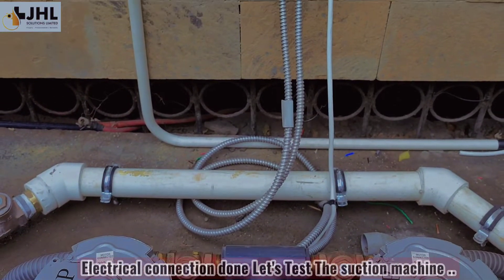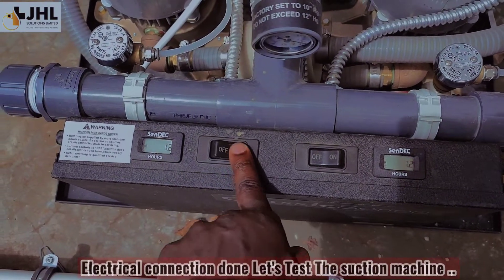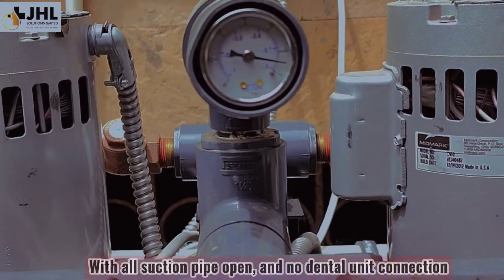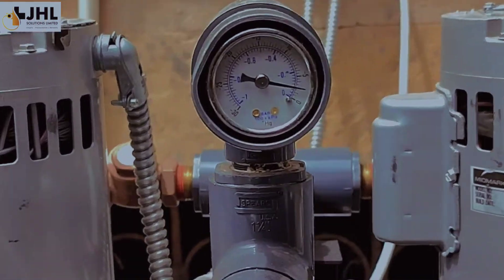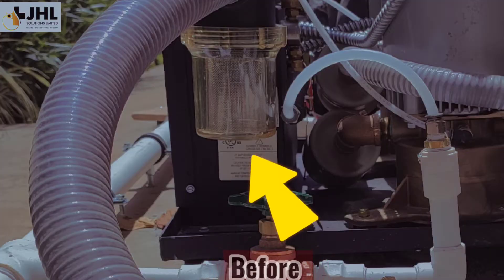Let's test the suction machine with all suction pipes open and no dental unit connection. All debris trapped. Before. After.